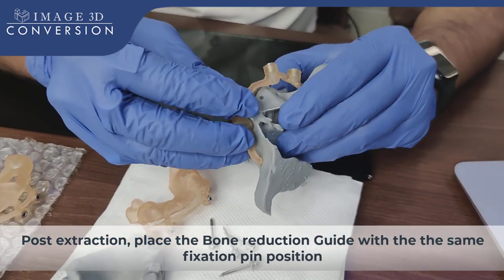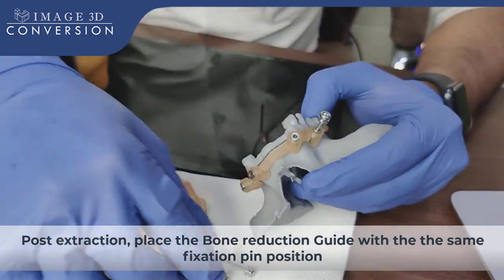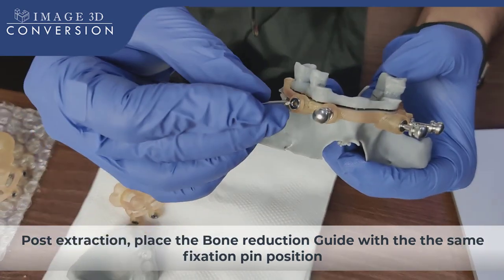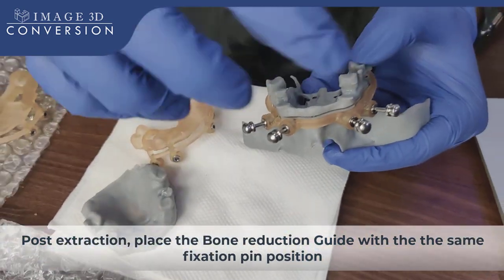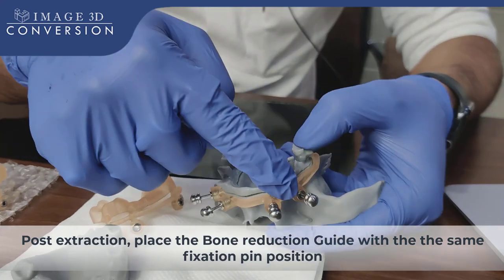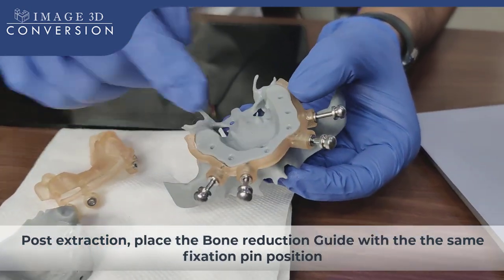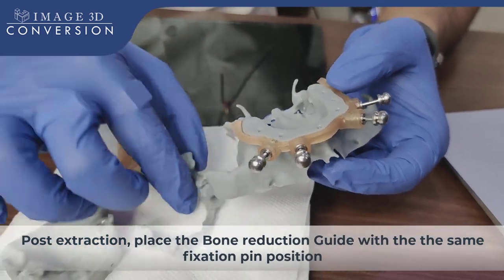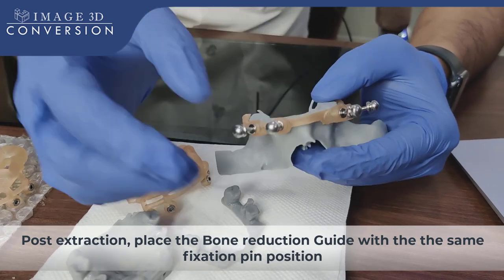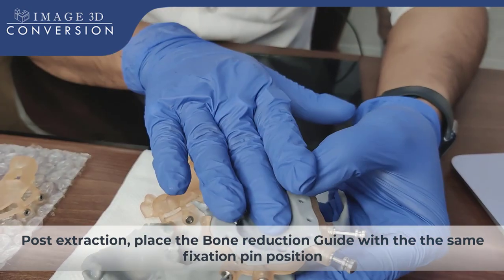On these fixation pin positions, we stabilize another guide — we call it the bone reduction guide. With the same fixation pin, we are stabilizing another guide. I'm just showing this for demonstration purposes with the fixation pins not fully inserted. Once done, I can do the bone reductions. This is the amount of bone reductions we have done. Before the surgery, you just need to verify that the fixation pin is going as per the planned position, and if there are any challenges in surgical guide stabilization, you will get to know in this mock-up surgery.